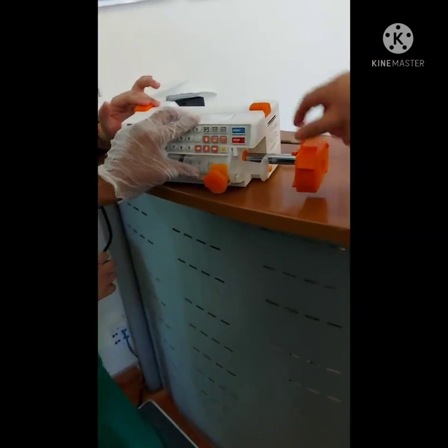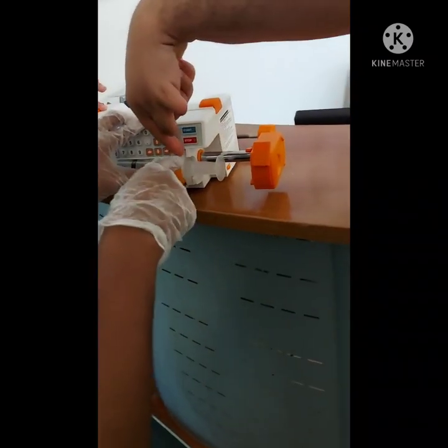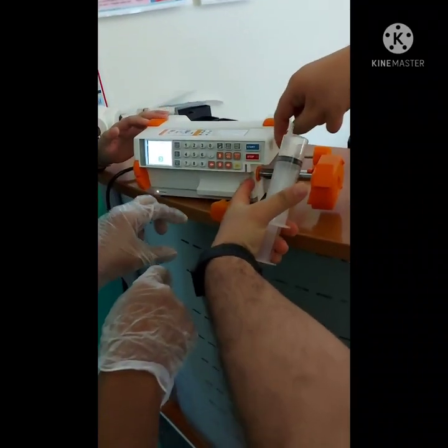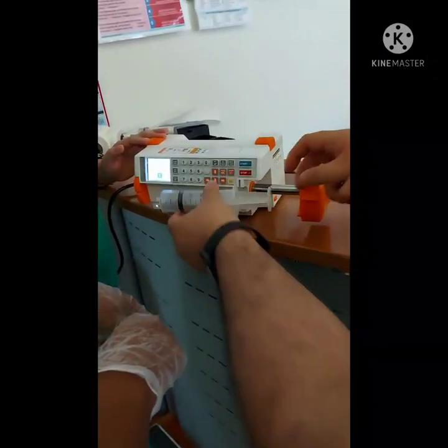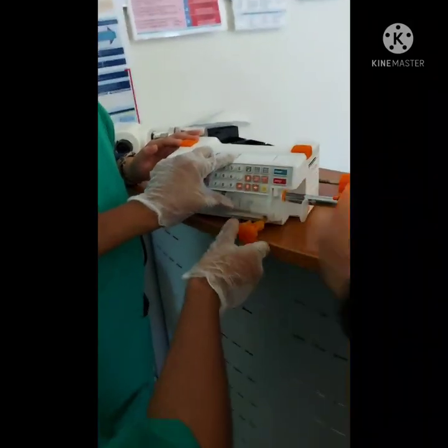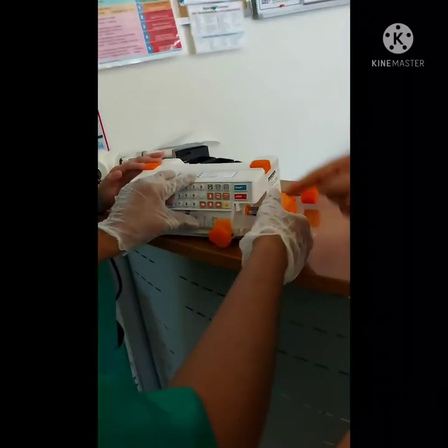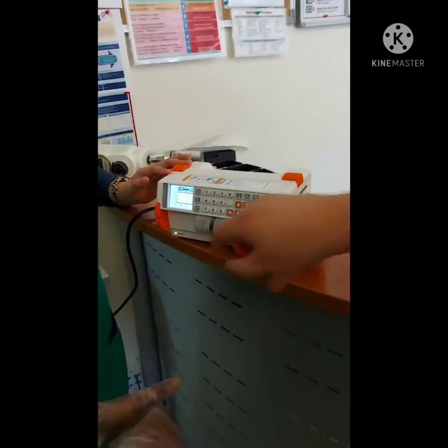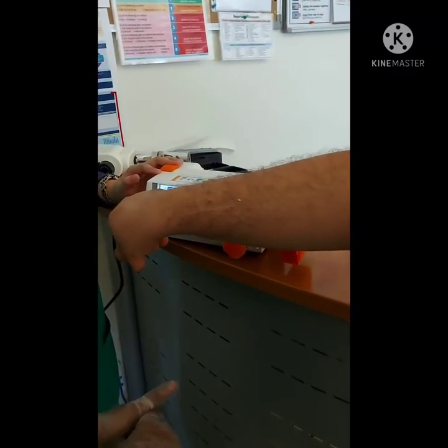How to install it? It's very important. It's here in this way. If you see, you have the way. You fit it here, and push. Now it's locked, and the machine already knows the value.